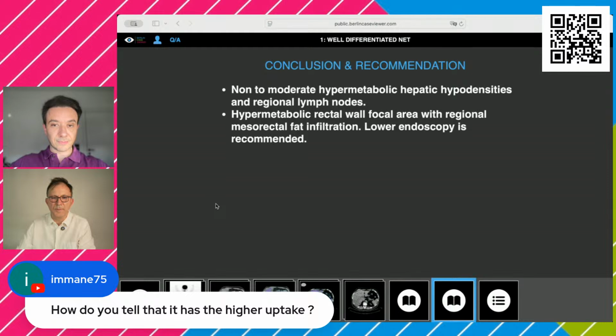So how do you tell that it is a higher uptake? You mentioned it one or two times, and one of our participants is asking it.